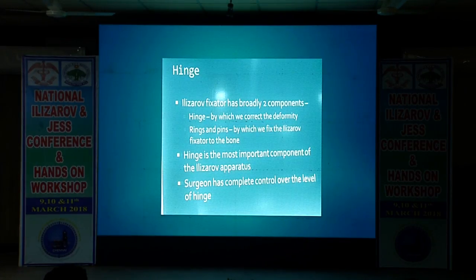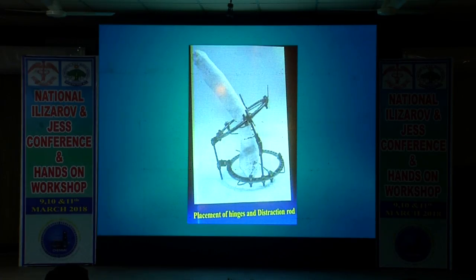And again, in the Ilizarov, the hinge is exactly where you put it at the deformity, and then you build your frames around it. And that's why before the procedure, you need to do the examination, do the X-ray, define the CORA, and then you can build the frame, and then you can exactly do the procedure. And again, the frames can be built pre-op like that.